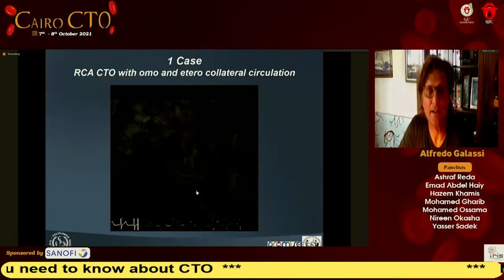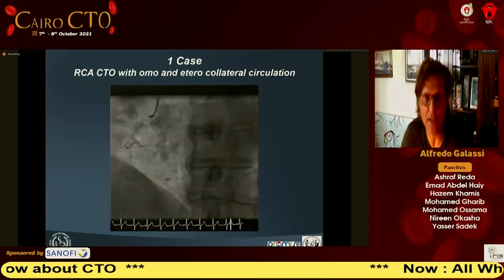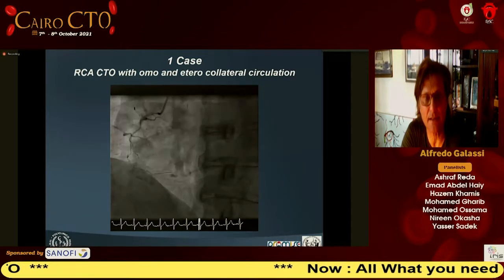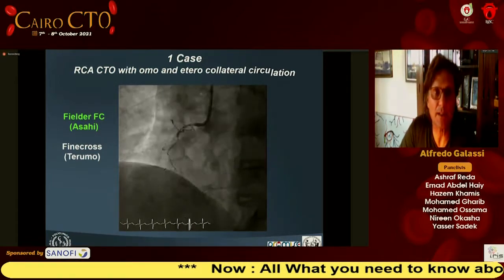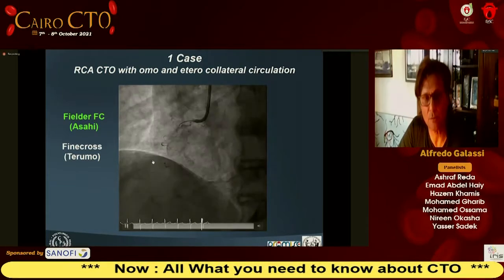And now I would like to show you some cases, to make the presentation shorter, which clearly show what is possible to do with a soft polymeric wire in a small-profile microcatheter.